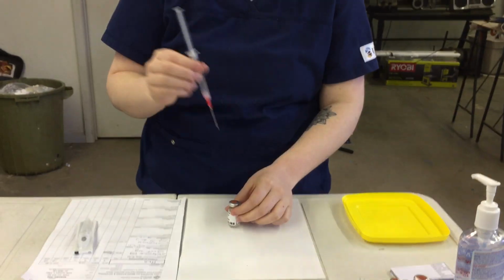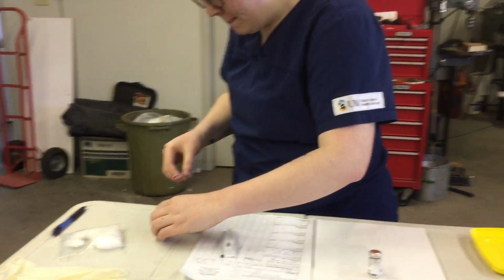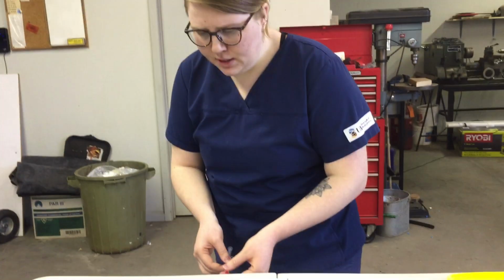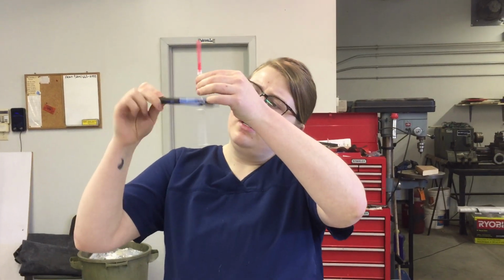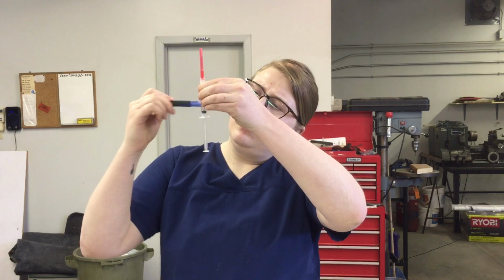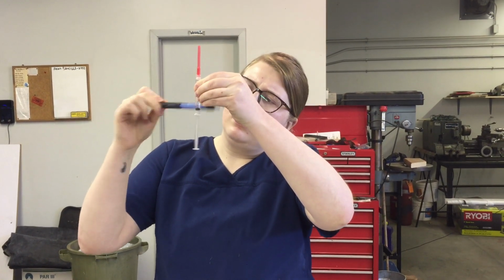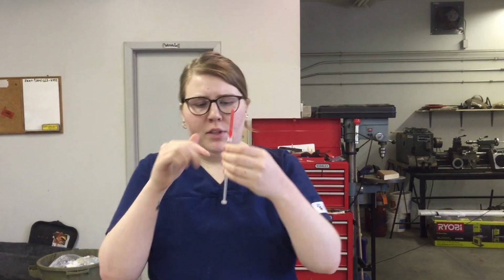So once I'm sure I've gotten the right amount, I'm going to flip this upside down. I'm going to take this out and I'm going to recap this using my scoop method. Okay, so that's good. At this point, I'm just going to knock out any bubbles that I might have in my syringe. So once I'm sure that I've gotten all that, I'm just going to pull back and make sure that all the medication is out of the blunt fill needle and in the syringe.